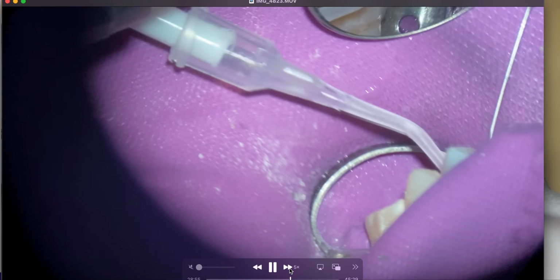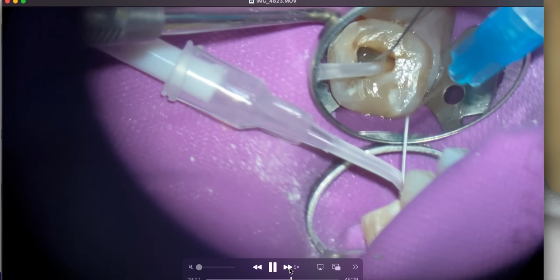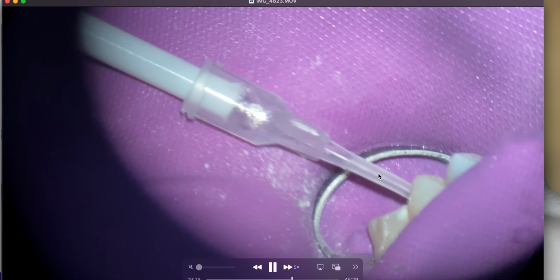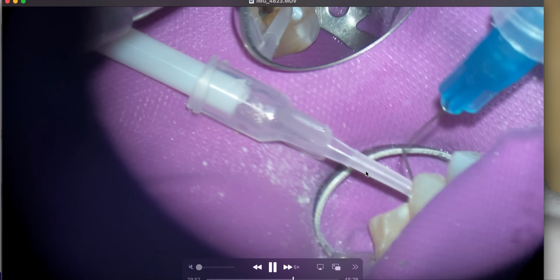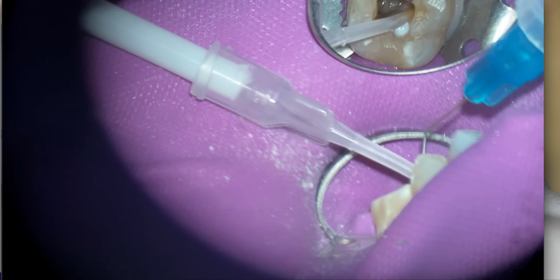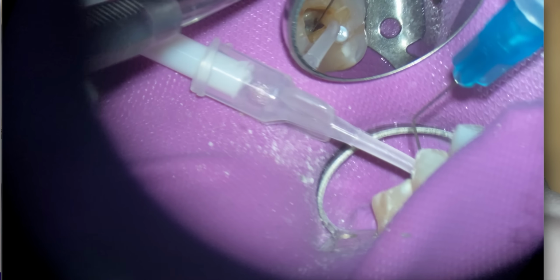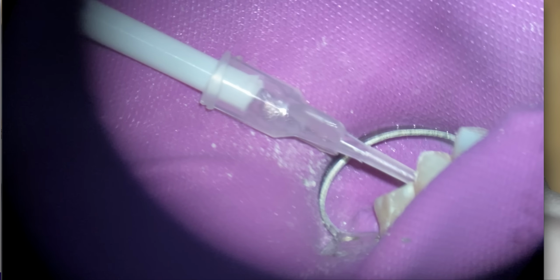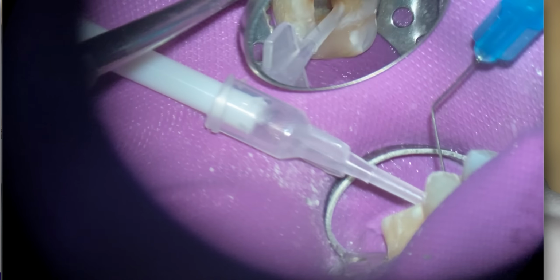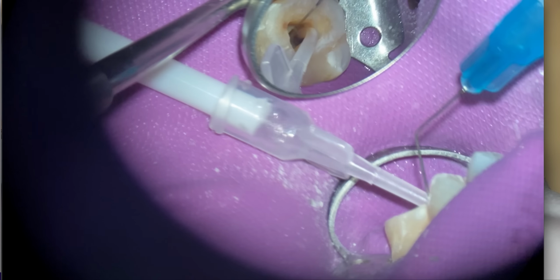And then, because it's a large palatal canal, I'm going to use negative pressure irrigation. So we're going to place that down the palatal canal. I bent it at 18 mils, and then I'm just going to hold that in there and run probably about 10 to 12. If I had a larger irrigating needle, I'd probably run like 20 mils of sodium hypochlorite down there. We've got these little wee ones in the room right now, so I'm just running 3 mils at a time. I think it came out to about 12 mils of sodium hypochlorite down that palatal canal and the other canals as well at the same time.